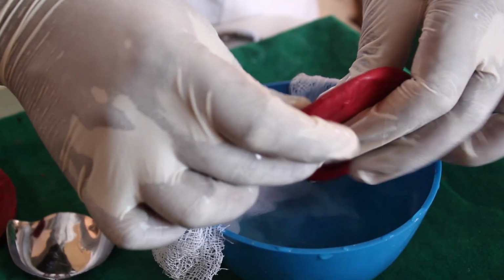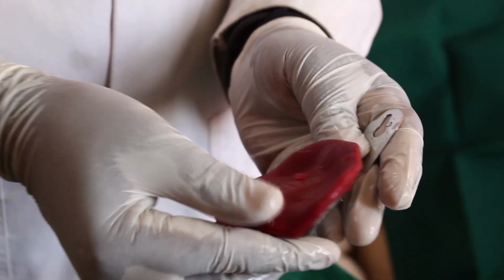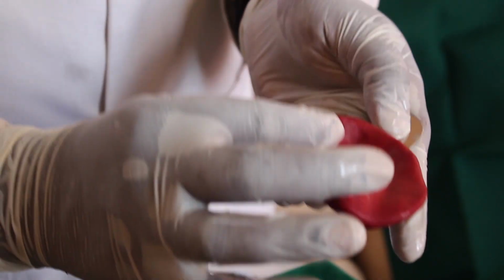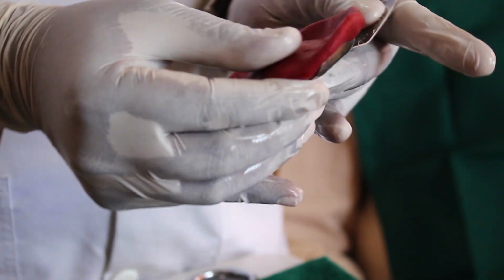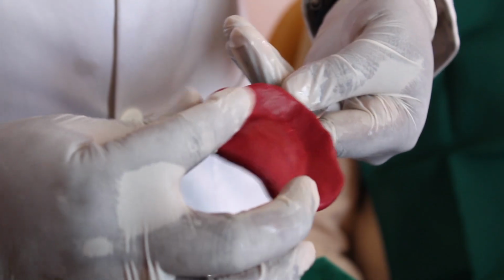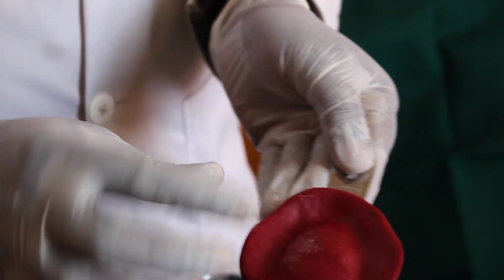So I am going to adapt this material onto the impression tray. After adapting it, you have to make sure that it covers the entire tray, and some amount of pre-molding is required. Otherwise the material will not flow like the alginate. Since it is a rigid material, we have to pre-shape it for a better impression. So now I have made a groove corresponding to the alveolar ridge.